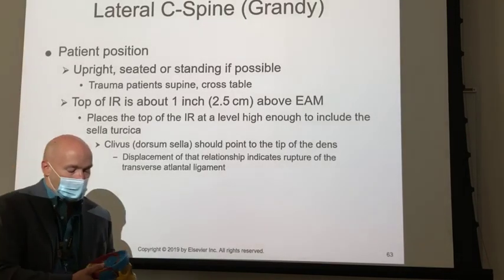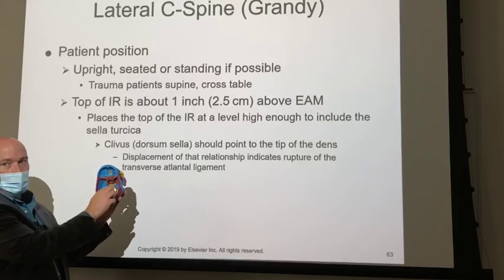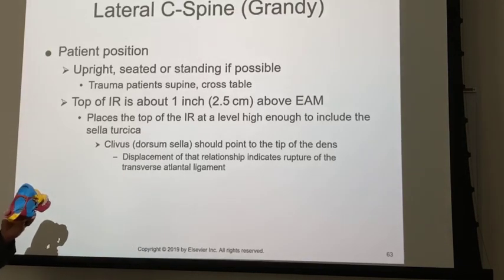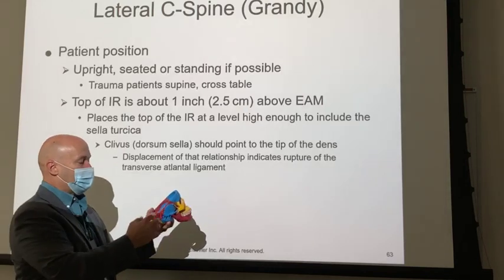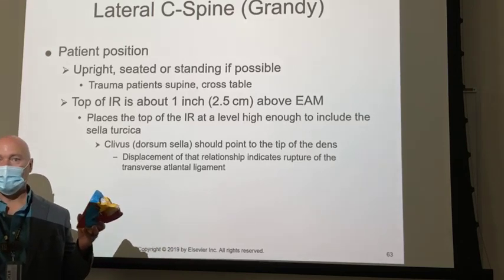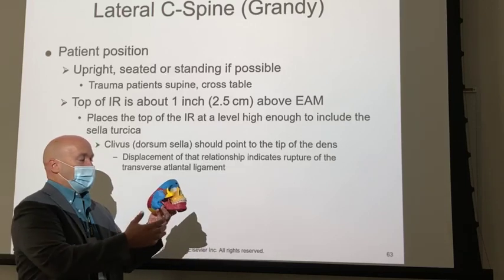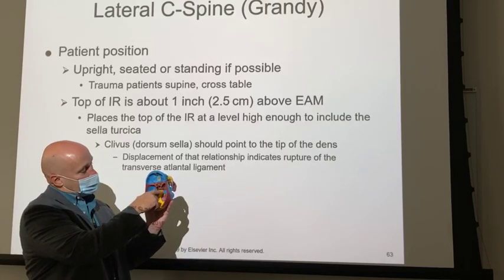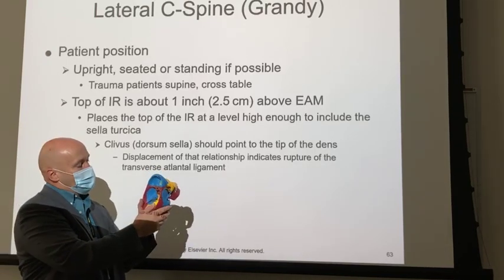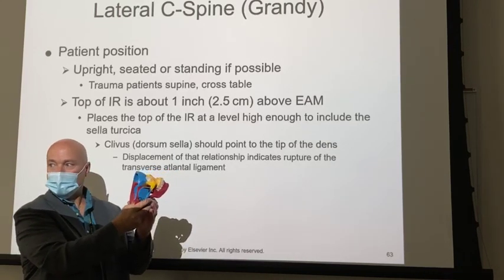the temple. And the reason for that is because, can you see where these two things point backwards and these tiny things kind of point forward? That's where the pituitary gland sits. And pituitary is irrelevant, really, for this, but that structure is what we call a sella turcica. And sella turcica is Latin for Turkish saddle. And again, that's pretty irrelevant, but coming off of the back of the sella turcica, that right there is what we call the dorsum, or the posterior sella. And what we want to see is the posterior sella pointing directly to the tip of the odontoid process.